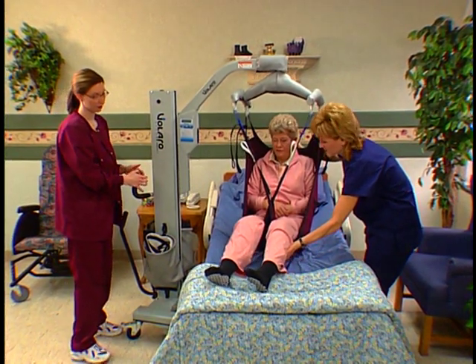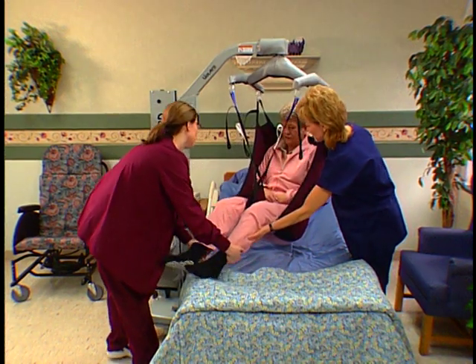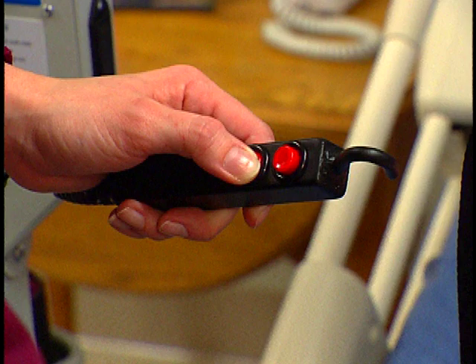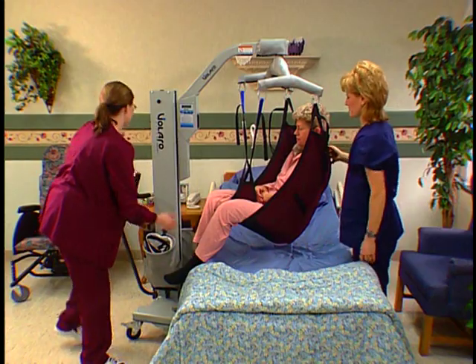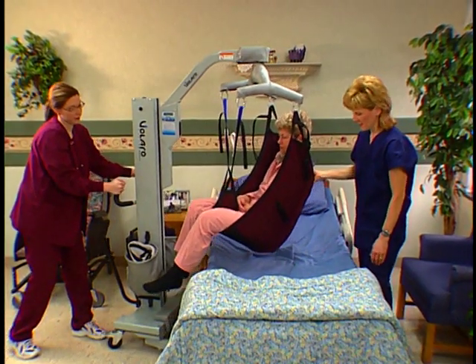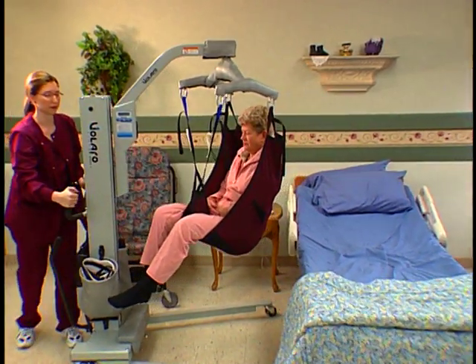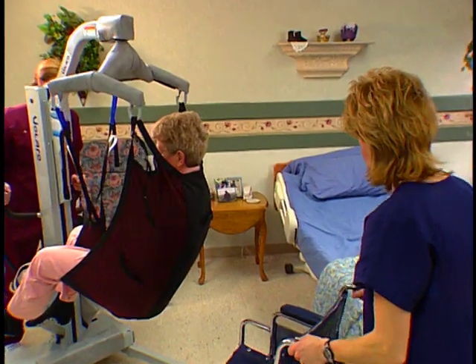Lift the person high enough to clear the bed. Then gently turn the person 90 degrees until the feet clear the bed. Note: use the remote control while turning the resident if it is more convenient. Move the resident to the chair desired. Position the patient over the chair by either moving the lift around the chair or moving the wheelchair under the lift. Lock the brakes on the wheelchair.